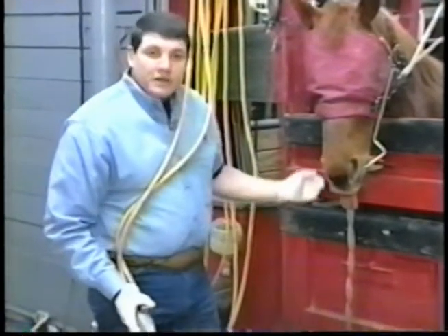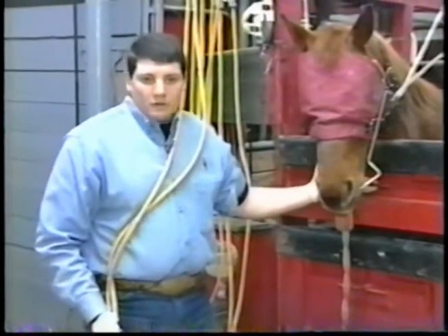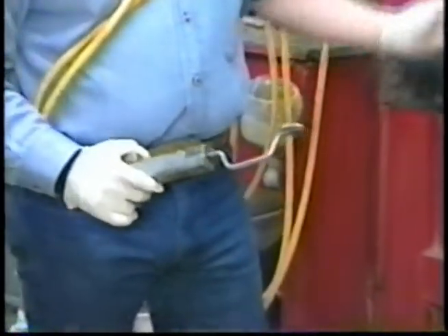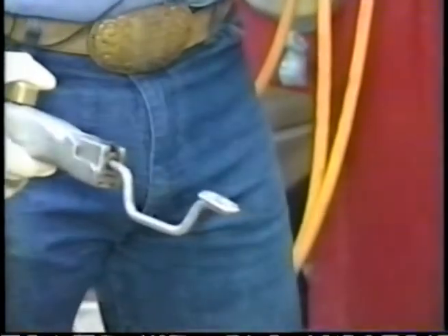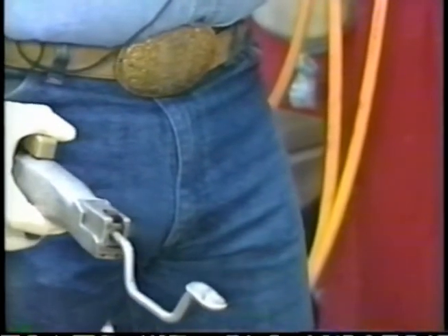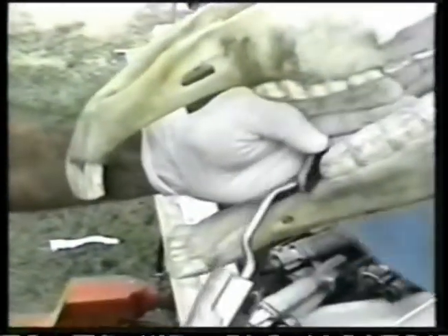Lastly, upon evaluation and owner preference, we decide whether or not we're going to instill a bit seat within this horse. This is a C-shaped bit to give a little more room at the tongue area. A bit seat is defined as the rounding of the upper and lower first cheek teeth on all four arcades to allow more room for the bit to be placed against the bars without pinching the cheek or tongue.